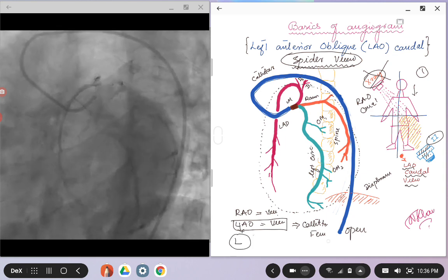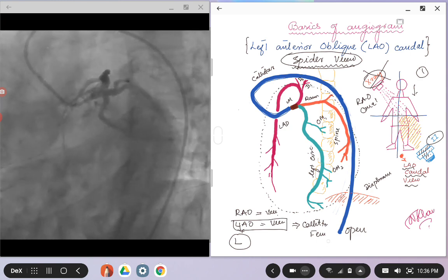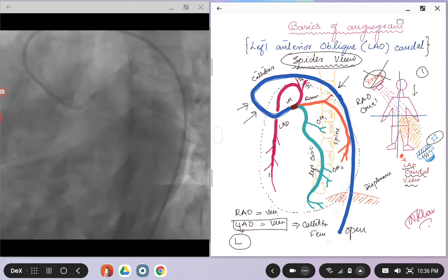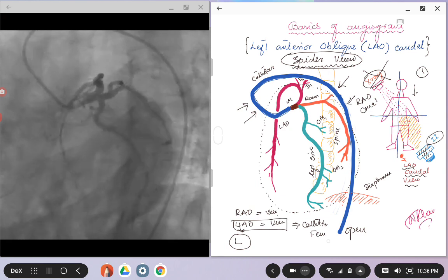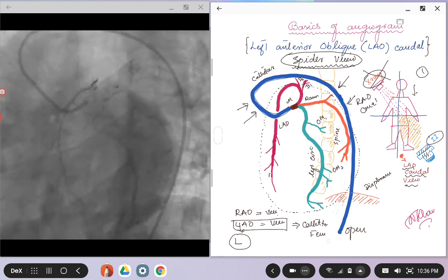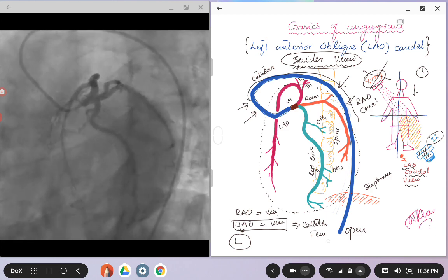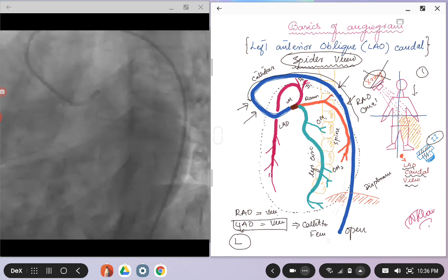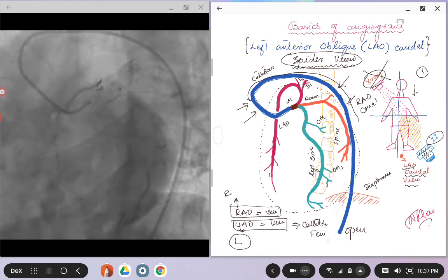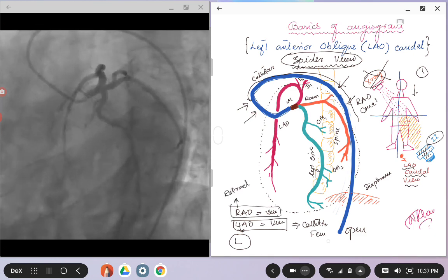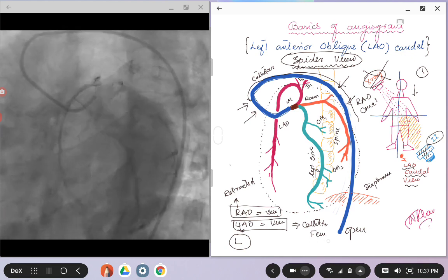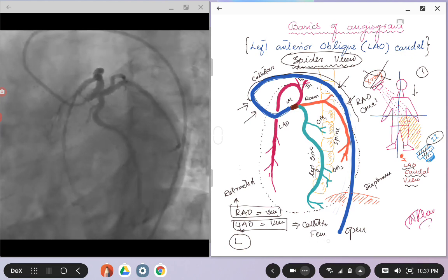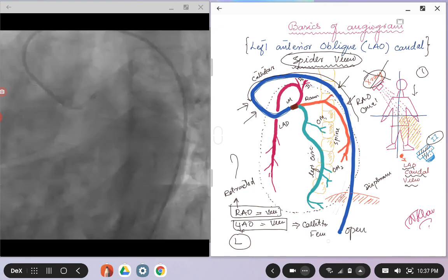So if you see this catheter here, this is a Judkins catheter, JL catheter, and you can see that it is all opened up. While when we were looking at the RAO views, RAO is called retracted. So these are the retracted views, a view where the catheters will be folded on themselves, so it might look something like that.